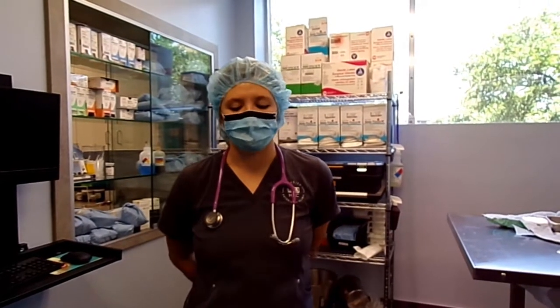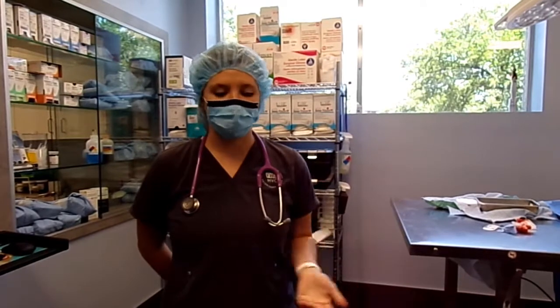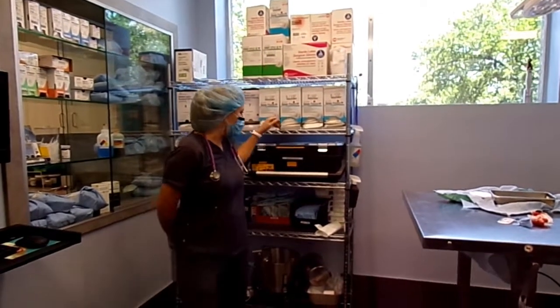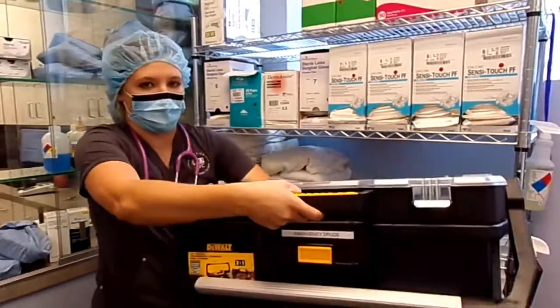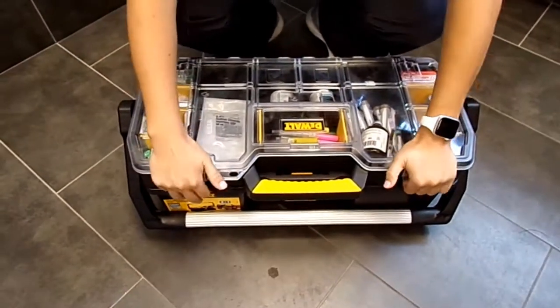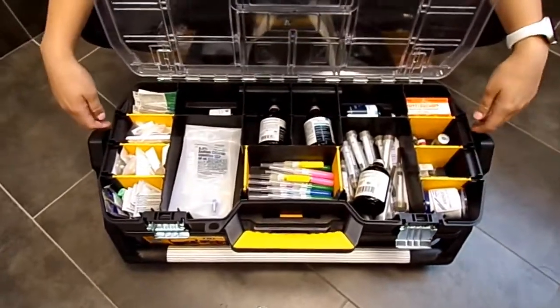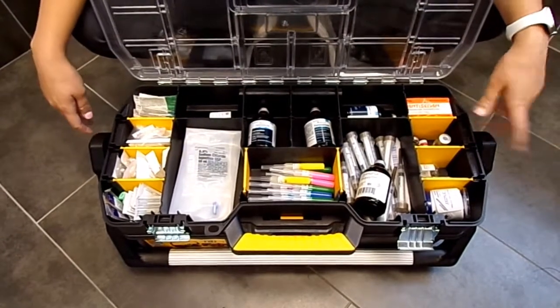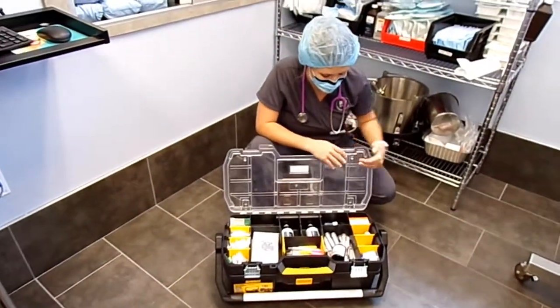I want to talk about what happens if there's an emergency under anesthesia. You're monitoring throughout the whole procedure and always keeping in contact with your DVM — if any pressures are getting low or you're worried, always communicate with them. Just in case an emergency happens, we have a crash cart here with all of our emergency drugs and anything we'd need: drugs, needles, catheters, anything you could possibly need during an emergency. Always keep your DVM aware of what's going on.